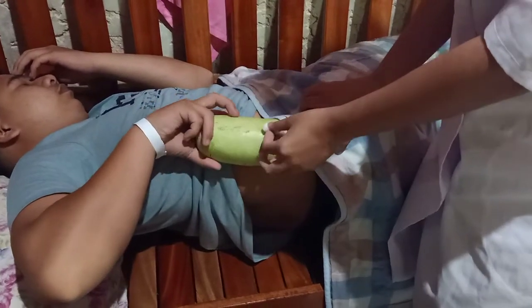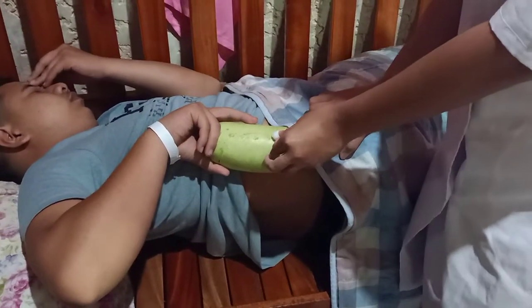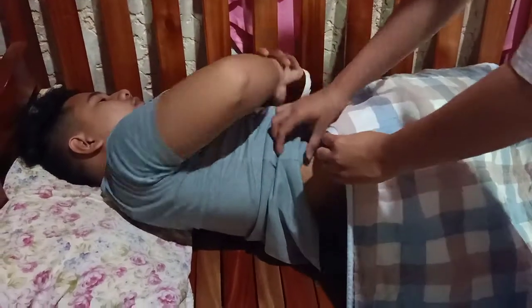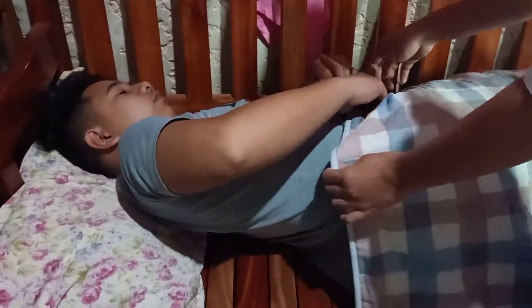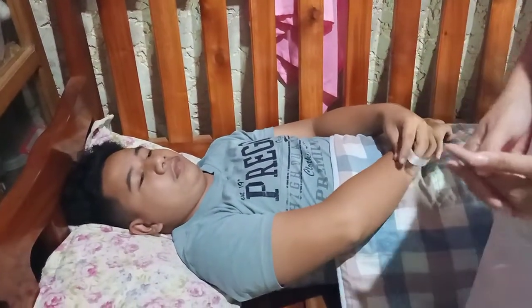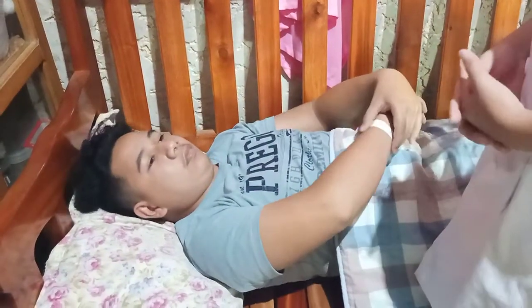Place the patient in a comfortable position and document the procedure. Okay, sir. We're done with the intramuscular injection. Thank you for your cooperation, sir.